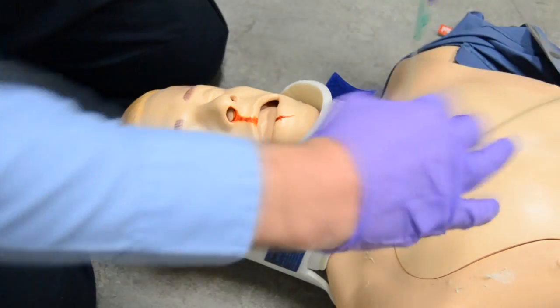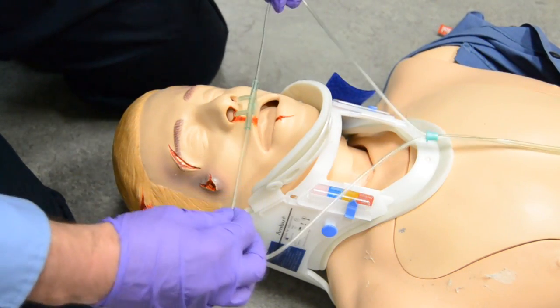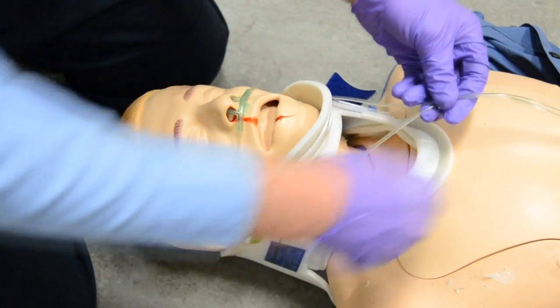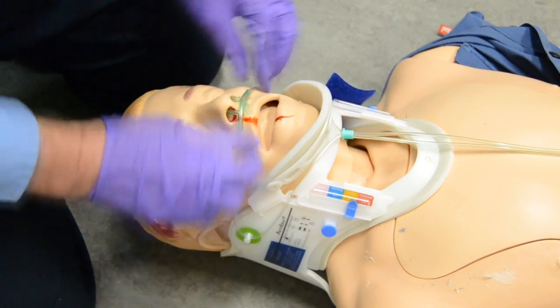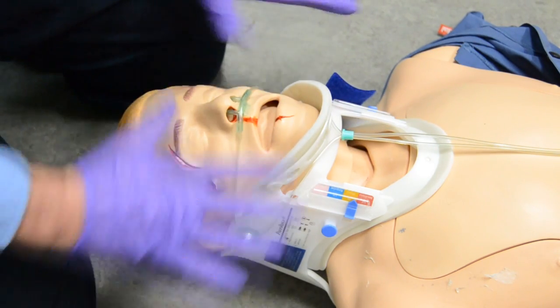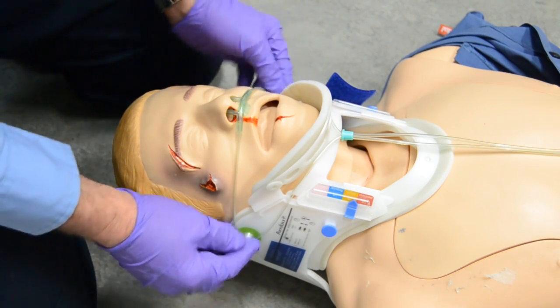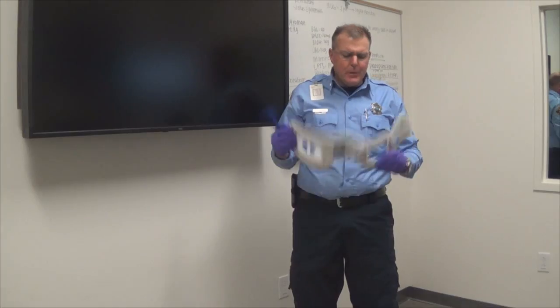We hook our nasal cannula up, put it on the liter flow we want. We take it, tell the patient what we're doing, come down, and we're able to go around each of those tabs and cinch it up right under the chin of the collar. Now you have that in place. How many of us have used tape all over the patient's face trying to get these to stay in place? Hopefully you'll start using these tabs for what they were originally intended for.